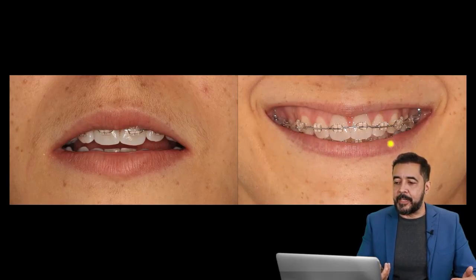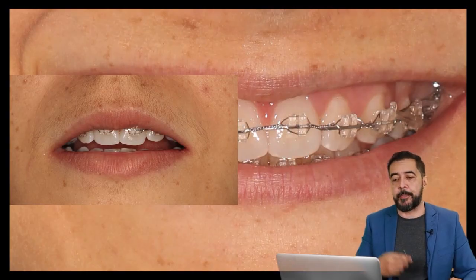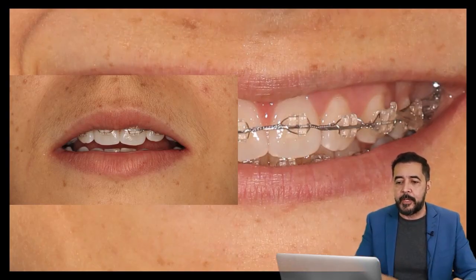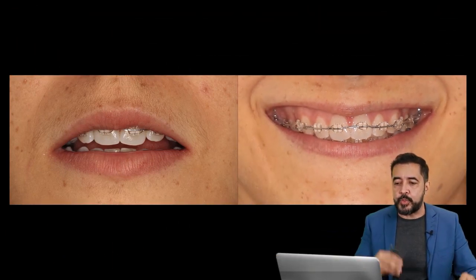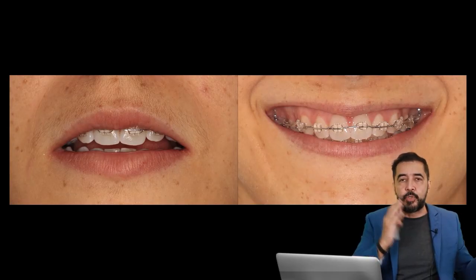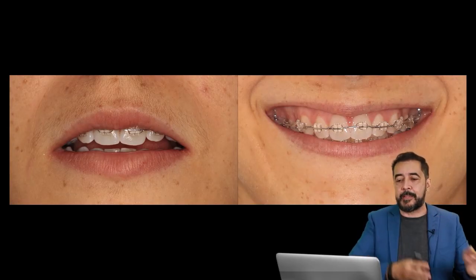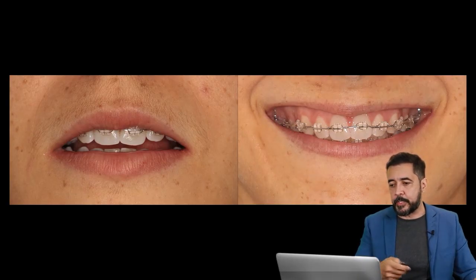And what I did was to do the correction by means of bends, in this case, a step down bend or extrusion bend. So we can manage to do this modification if the patient doesn't want it during the treatment, but at the beginning of the treatment, we can also do this, avoiding sometimes the need for this kind of bends during treatment, because we anticipate the mistake and we did it before treatment. This is very important.